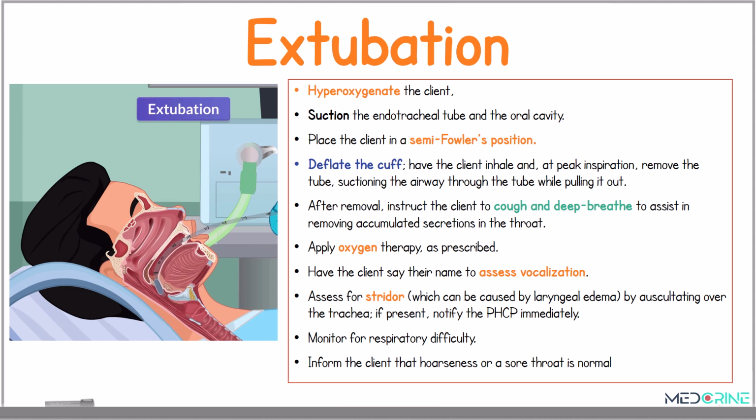And then you need to monitor for respiratory difficulty and inform the client that hoarseness of voice or a sore throat is normal and will subside over time.